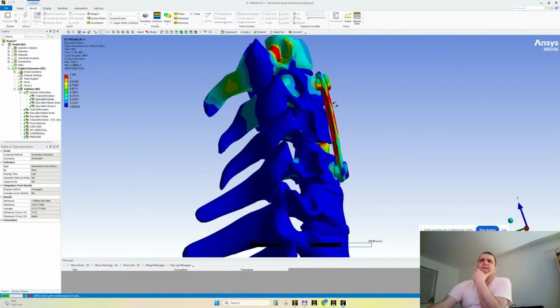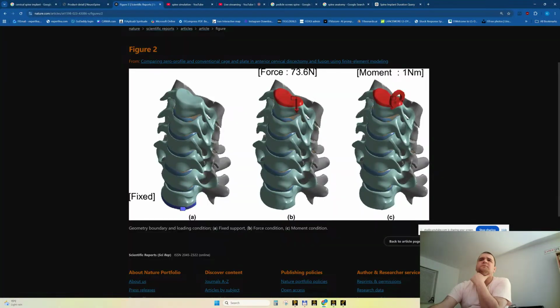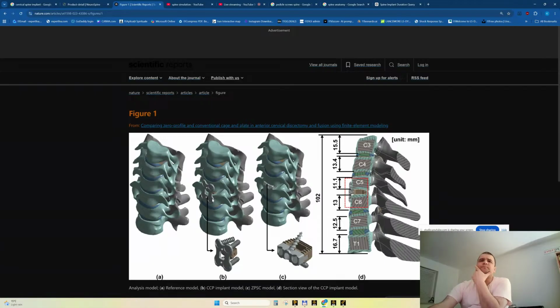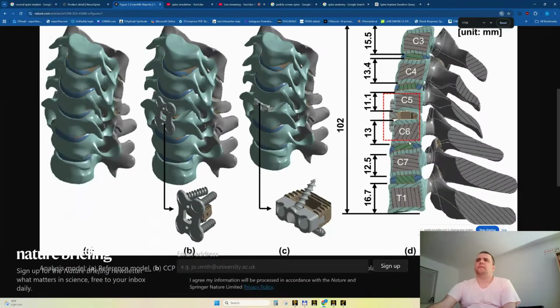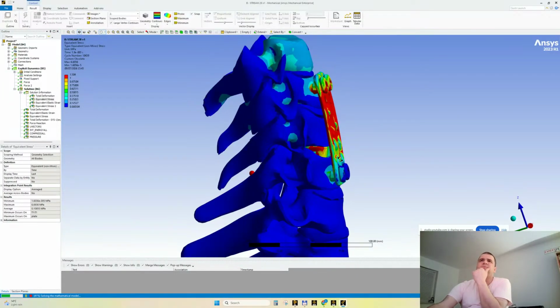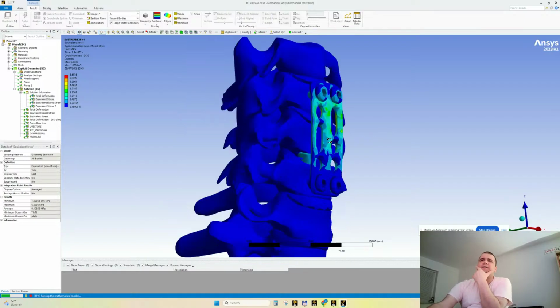Now I see that I didn't apply the plate optimally. The plate should have been shorter, and the plate should only enclose this portion. This, look here. Yeah. In my model, the plate doesn't do much because it allows flexibility here. The plate should be focused only here. Yeah, it's a mistake.